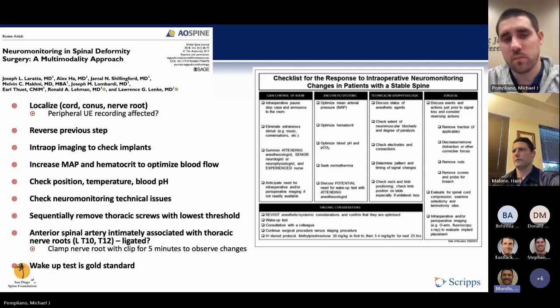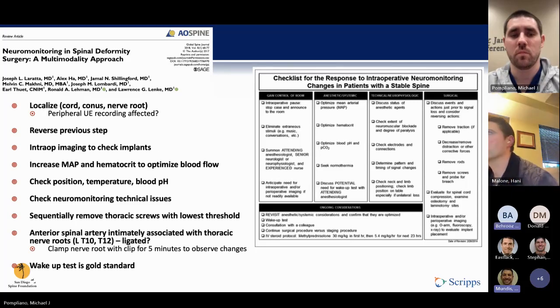Oh, I see what you're saying. We don't do it all the time, Dr. A. What he's referring to is that some of the lights have cameras on them. If you keep the camera on the surgical field, then the neurophysiologist could technically be watching the operation and correlating live with what they're seeing. That's what you're referring to, right, Doctor? Yes. I think it depends on which room we're in, and also if we have visitors and things like that, we're obviously a lot more into the videos.